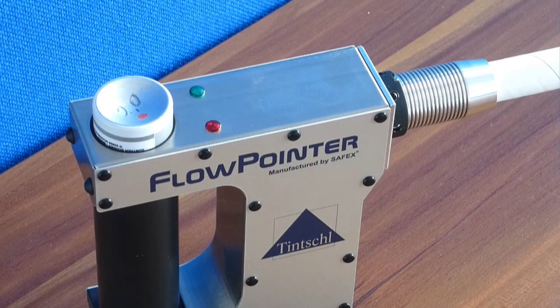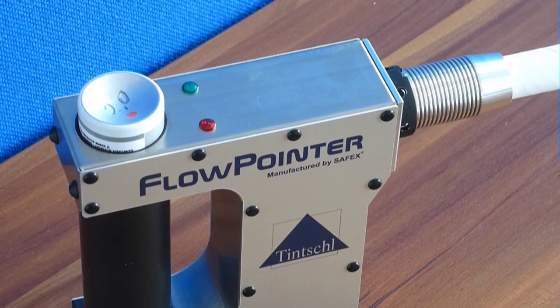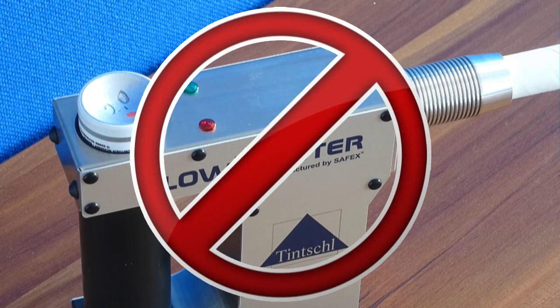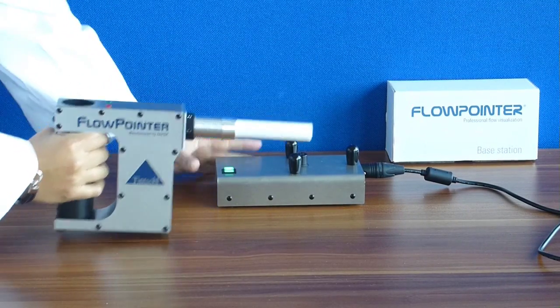When the green light blinks, the flow pointer soon needs to be recharged. Please do not use the flow pointer with the red light on. Recharge the flow pointer before the next use.